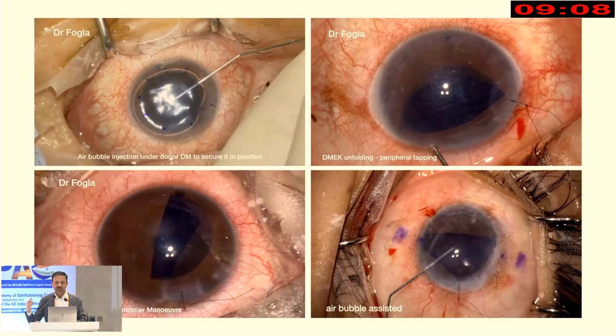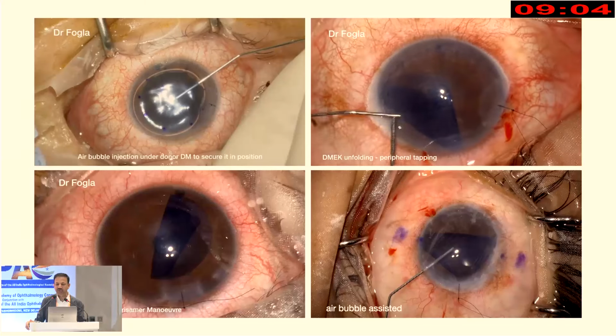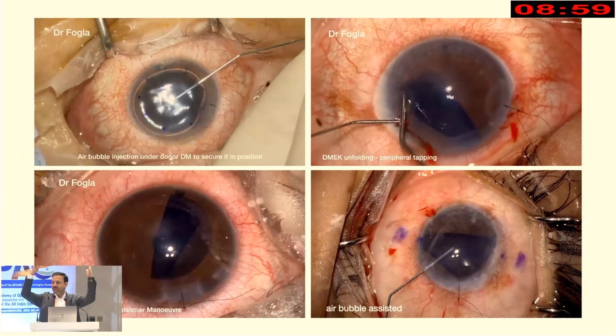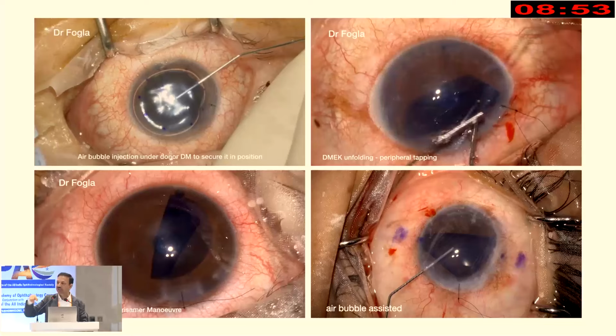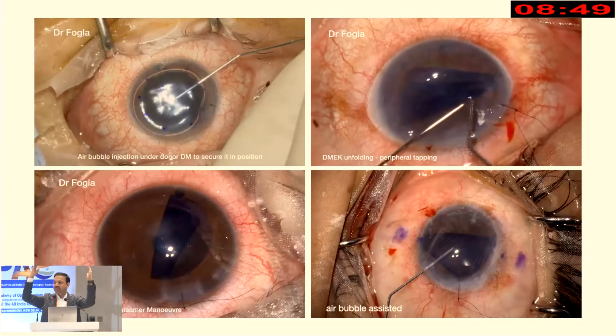So here you can see you have a taco fold. If you have a taco fold, you give a short burst of fluid through the side port, just to move this fold, which is like that, you make it like this. The direction of the fluid is not towards the donor tissue, but below, towards the iris. So you want to create a turbulence in the iris. Just give a short burst, and that moves this taco to straight.